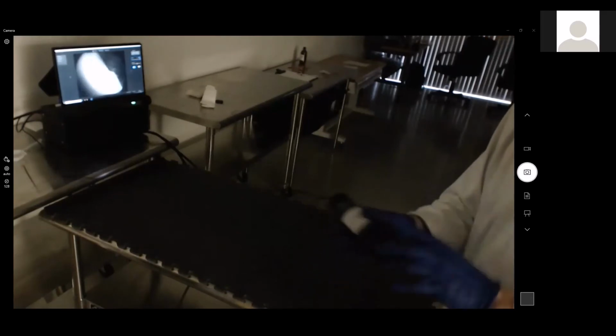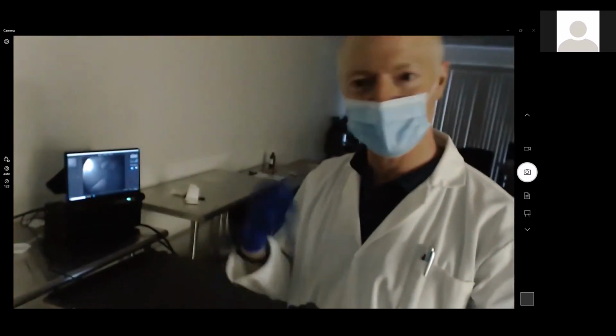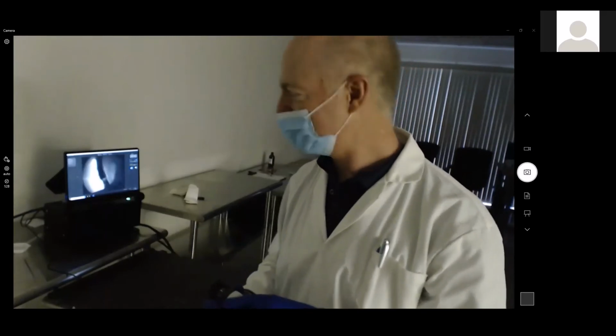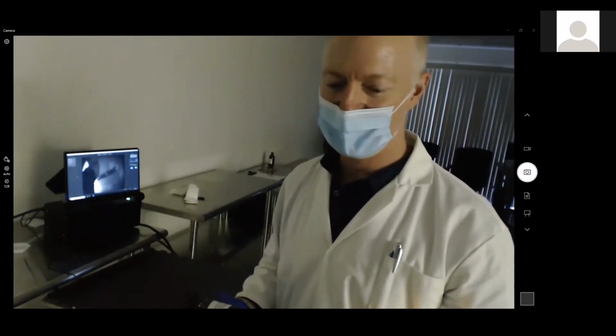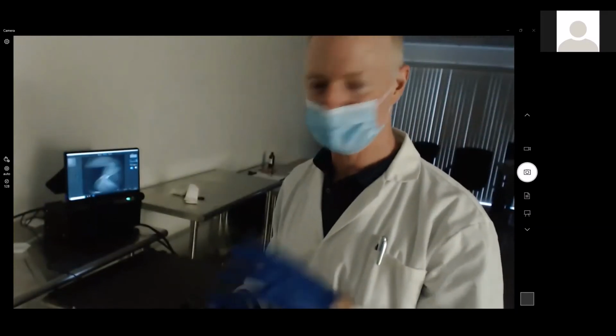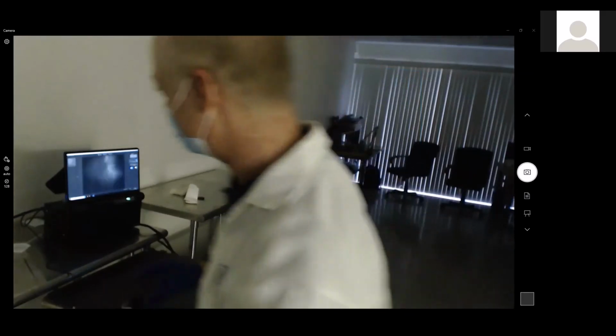So that's one of the reasons we were kind of playing with this. Wanted to give an example. You can see some of the positives and negatives and some of the implications around fundoscopy. That's kind of why I wanted to bring this into the equation. I'm sure, here in the not too far out future, we're going to be doing some other things with some of these features of functionality, so stay tuned on that as well.